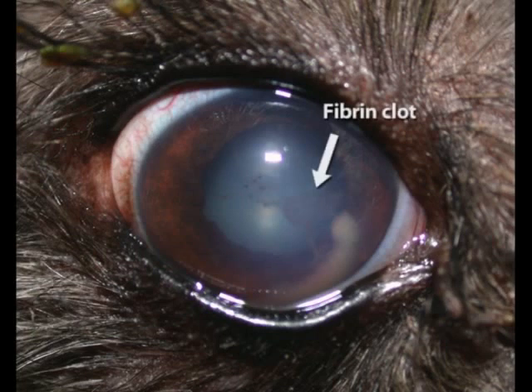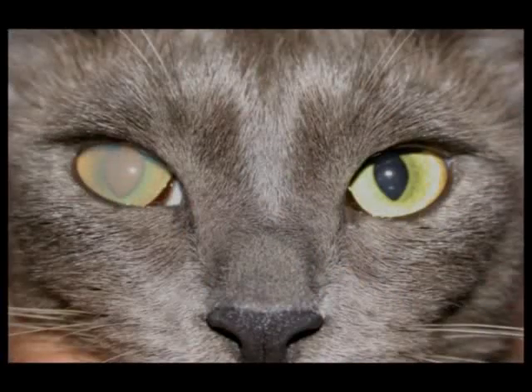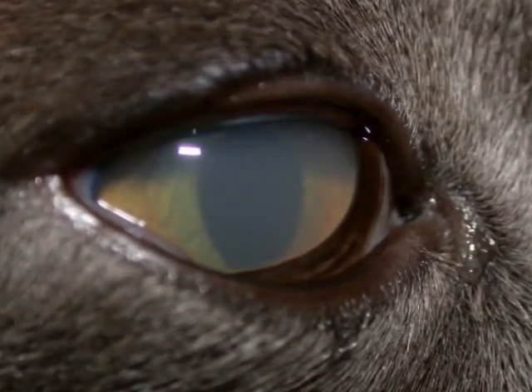A fibrin clot is a more obvious sign of protein in the anterior chamber. Hypopyon and keratic precipitates are also evident in this case. Lipid may also be seen in the anterior chamber, creating a turbidity that can be confused with aqueous flare. Affected animals may have systemic hyperlipoproteinemia.